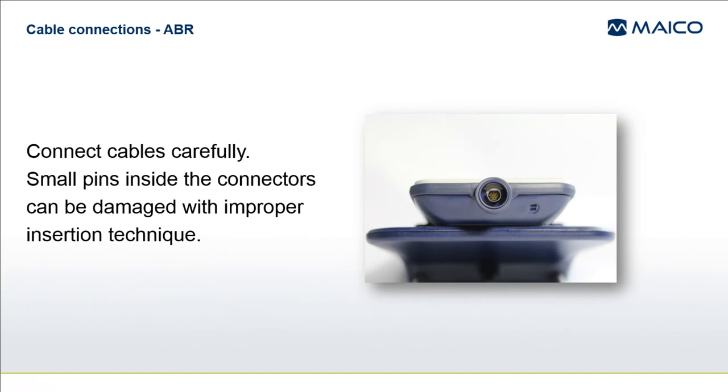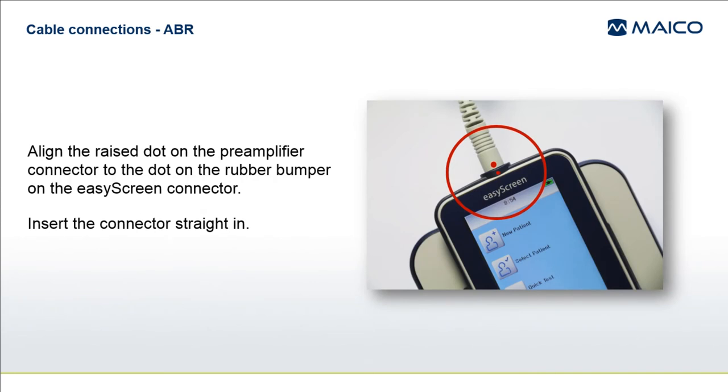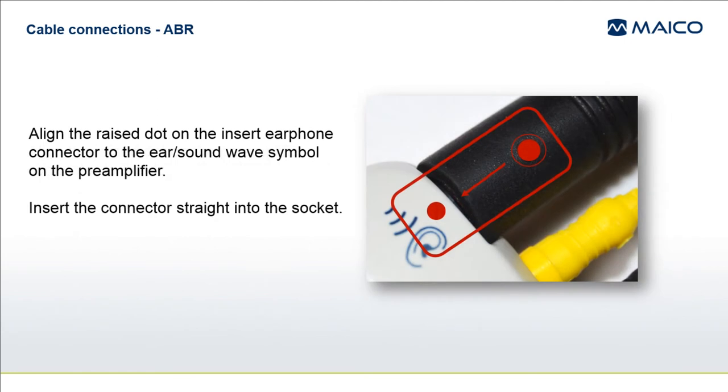Cables and their connectors are sensitive and should be treated carefully. The connectors on the pre-amplifier and each of the transducers contain several small pins that connect into corresponding holes in the socket. Find the raised dot on the connector and the raised dot or symbol near the socket — this will guide you about proper alignment. Once aligned, push the connector straight into the socket. Do not twist the connector as you insert it, as this may damage the small pins.